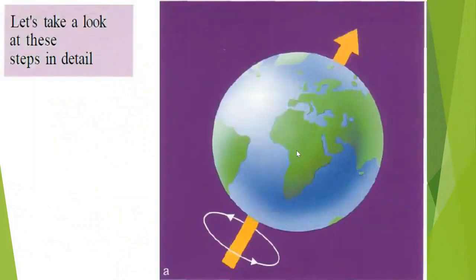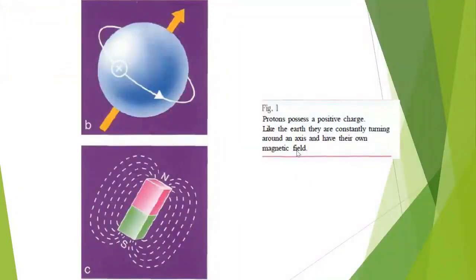This charge moves in a spinning motion, rotating continuously around itself, similar to how the Earth rotates around its own axis. Despite having no external charge, it still generates an intrinsic magnetic field, thus becoming a small magnet. The proton, which possesses a positive charge and spins around its own axis, effectively acts like a magnet. Our human bodies contain countless billions of protons, therefore we essentially have numerous magnets within us. However, does this imply that we are capable of attracting the metals around us?